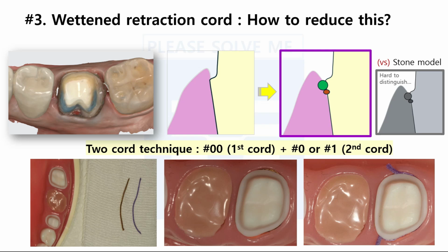However, the important thing to keep in mind is that if you leave the cord inserted for too long, it will absorb moisture and swell like a sponge. Therefore, as emphasized earlier, it is necessary to complete the scan mission as quickly as possible after inserting the cords. A video of Dr. Zhang preparing a crown and Chen scanning will provide additional tips to understand how to overcome the deep margin issue. Let's have a look.